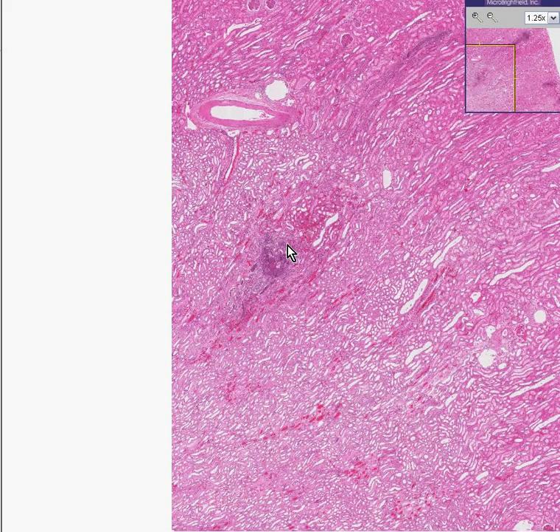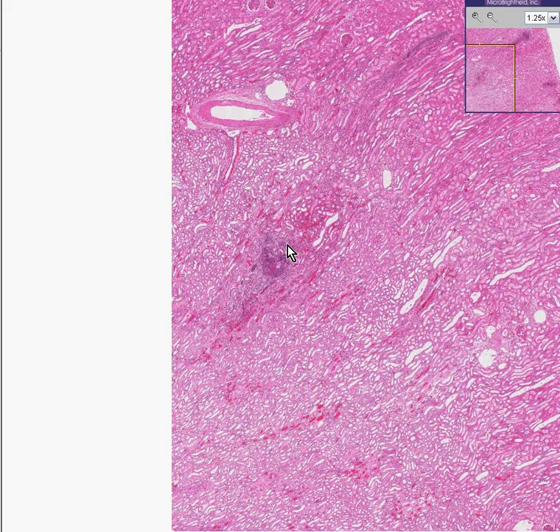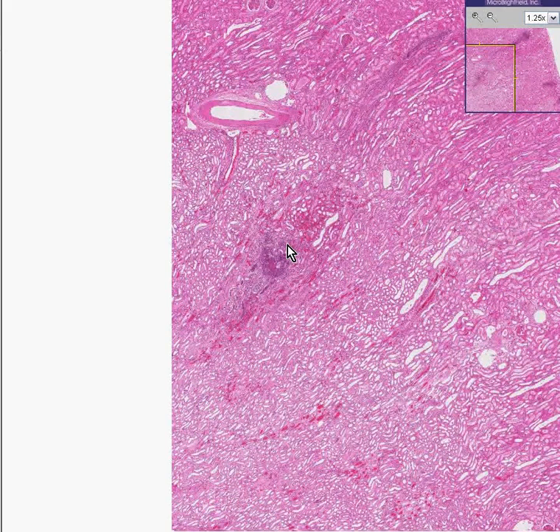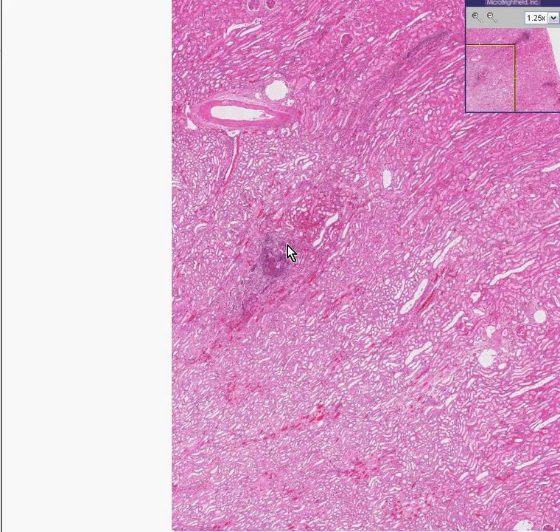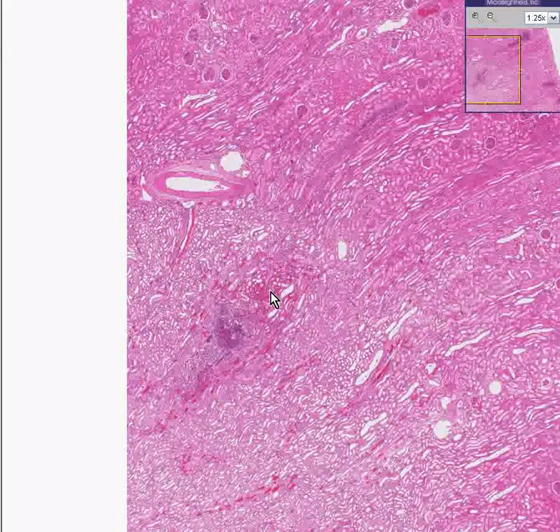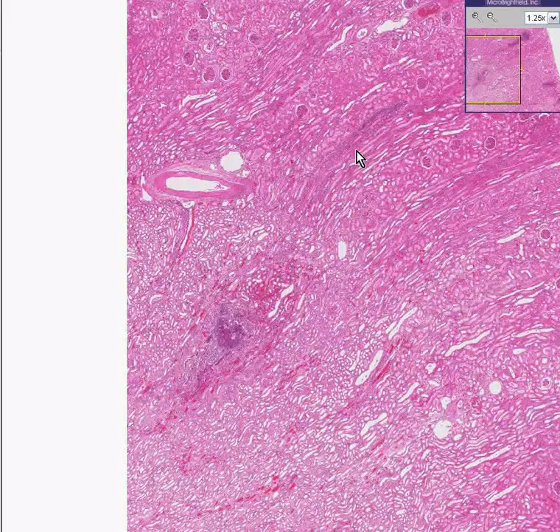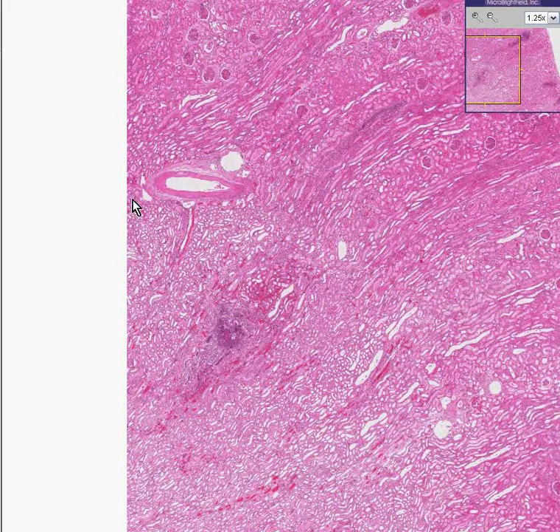This is a patient with bacterial endocarditis, and those vegetations can shower infected little particles anywhere. The kidney receives a very huge portion of the cardiac output — approximately 30%. So a lot of the blood flow from the heart is going to the kidney, and that's what's causing these little septic abscesses here and there, in the absence of large areas of inflammation like you might see with a pyelonephritis.